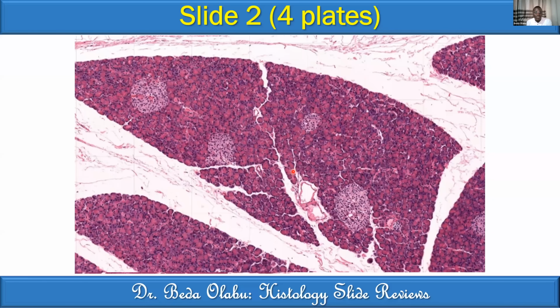Looking into the lobule, well, I'm not repeating the issues of loose connective tissue, trabeculae. We confirm that one. Looking into the lobule, we see that the lobule has two major components in the parenchyma. We have this region here, which is serous acini. These are serous acini, but perhaps a higher magnification will confirm that one.